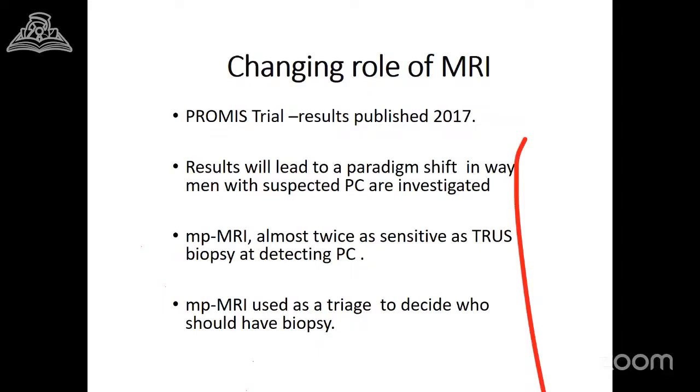This supports a shift in clinical practice where multi-parametric MRI is used as a triage test to determine which patients actually need a biopsy. The ultrasound biopsy is invasive, and this helps to avoid unnecessary invasive procedures and improves diagnostic accuracy.